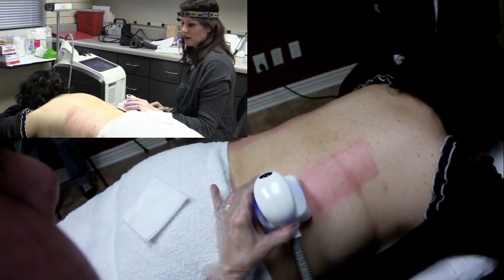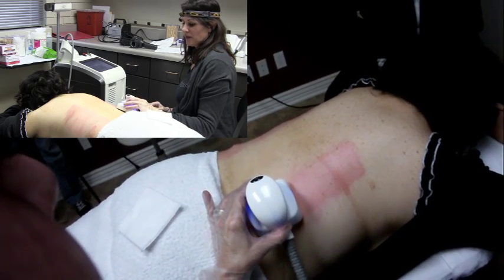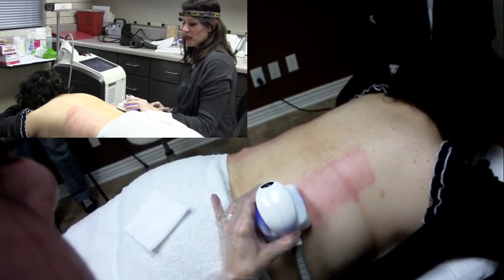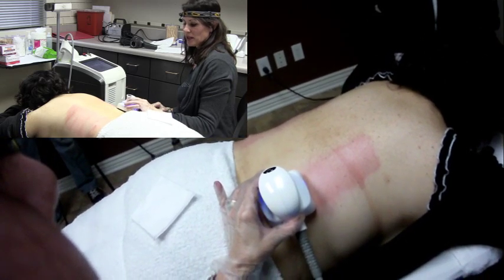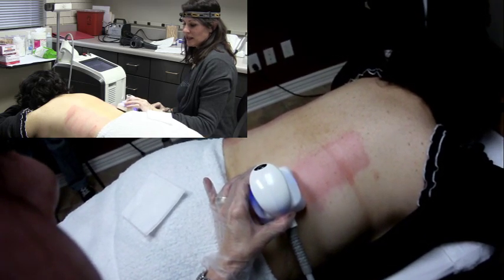We're working on the back right now — a lovely area that a lot of us women struggle with, the back fat. It's a very difficult area to work out, so this is a really promising procedure. I've seen some before and after pictures and I'm pretty amazed by the whole thing, so it's an exciting addition to the aesthetic world.